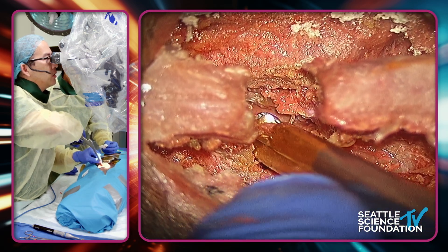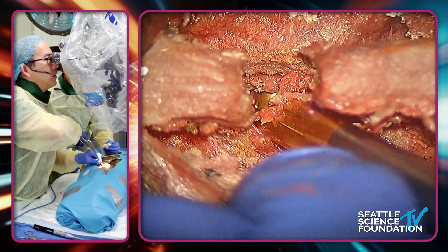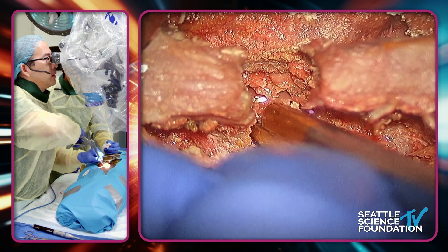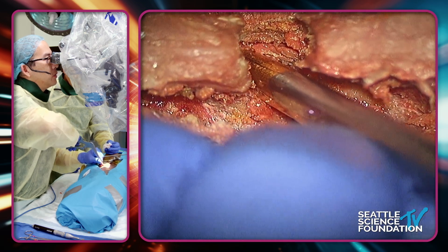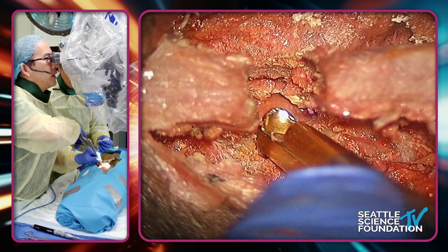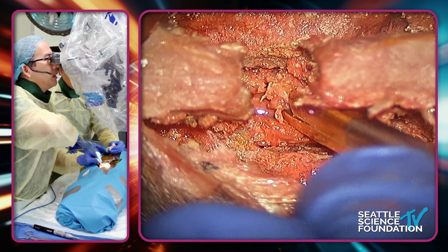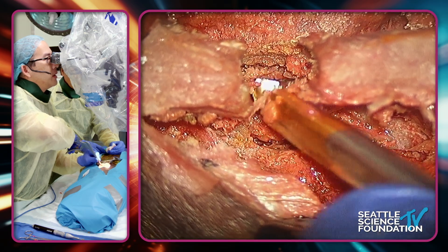You can quickly take that ligamentum knowing you have a nice plane dissected. Notice I've already trimmed this bone so that it's no longer stenotic. See how the Kerrison just drops down into the lateral recess so that you can rapidly take these bites. Now at this point, because you're seeing the thecal sac, I would encourage you to slow down a little bit and really take your time because this is where you get to really be one with the nerves. We're getting a nice decompression here all the way out into the lateral recess — it's absolutely critical to get this. If you don't get this part, the patient's not going to be happy when they wake up.